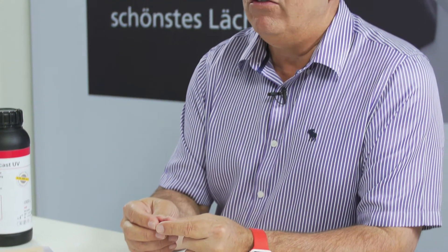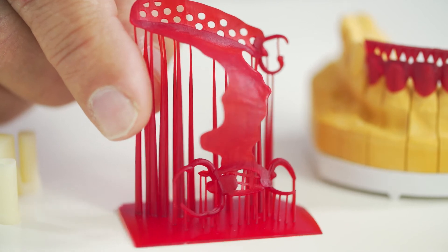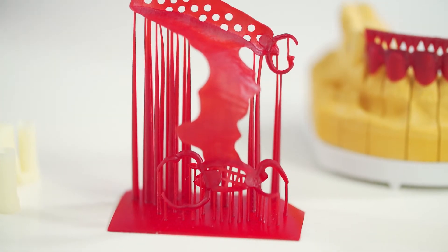If you do a lot of pressing, it is ideal to design it, print it, and basically go through the process of pressing your ceramics into it.